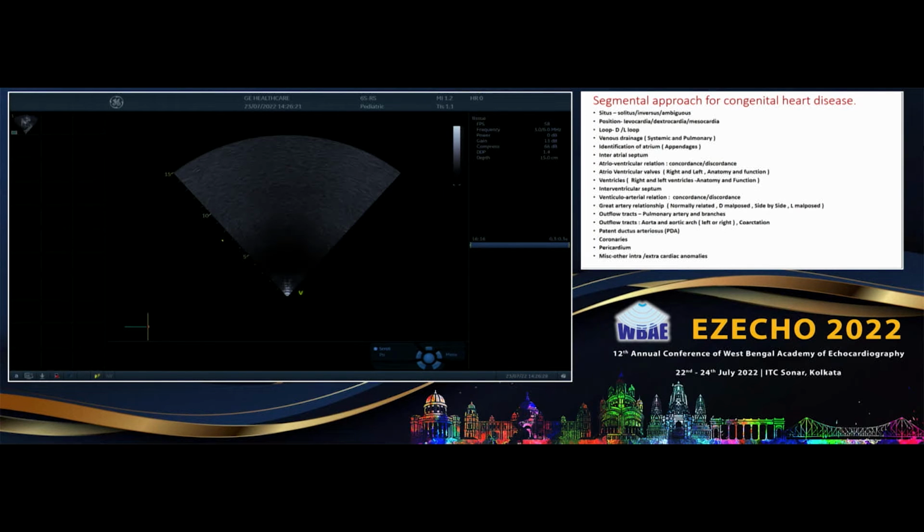The more important thing is to have an idea how congenital imaging is different. Getting a history, saturation, clinical examination, and then putting the probe, sedating the child. That is a big 30-minute discussion, how we need to restrain the child. So thankfully the baby is sleeping and possibly will be nice to us.